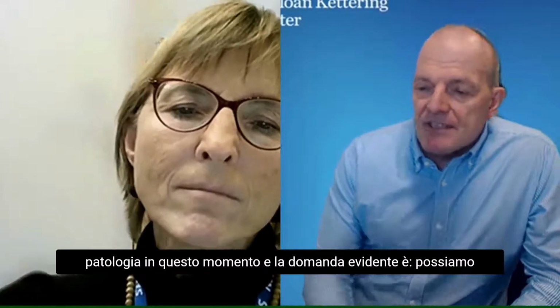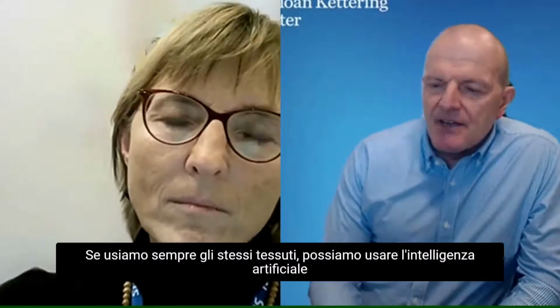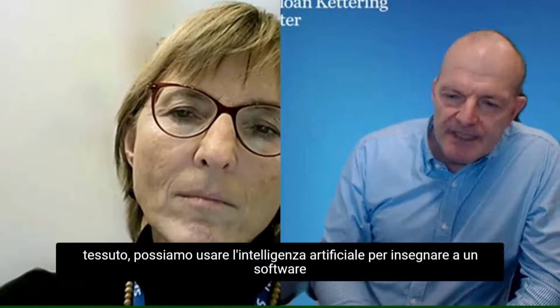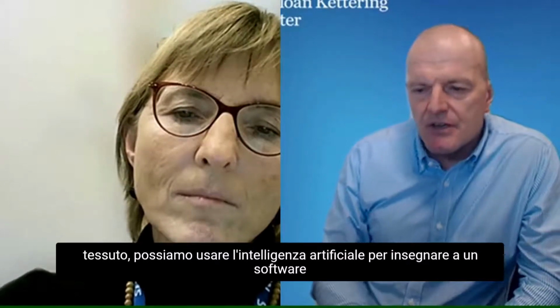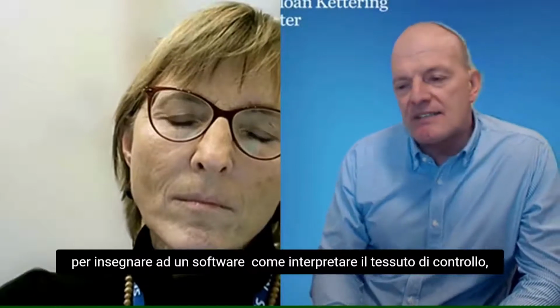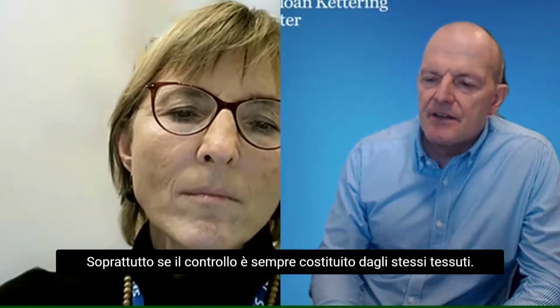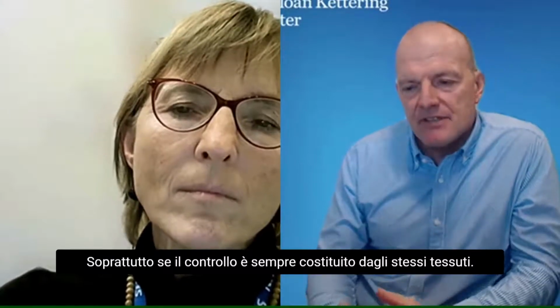And the evident question is, can't we put IHC on the next level? And that's exactly our idea. What you asked is, if we always use the same tissue, can't we use artificial intelligence to teach a software how to interpret the control tissue, especially since the control tissue always consists of the same tissues?